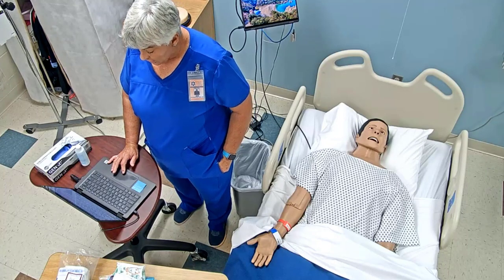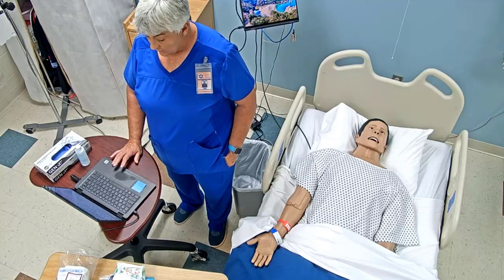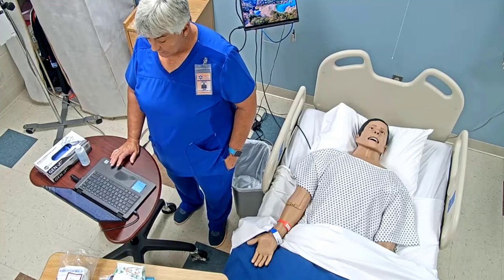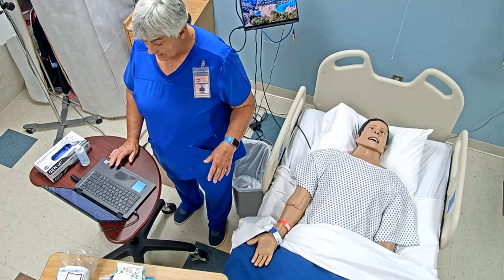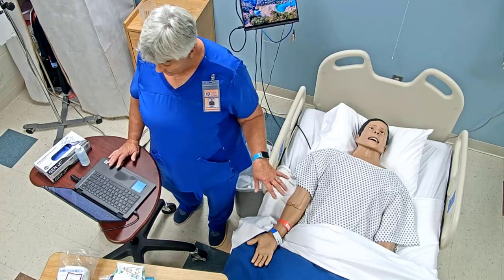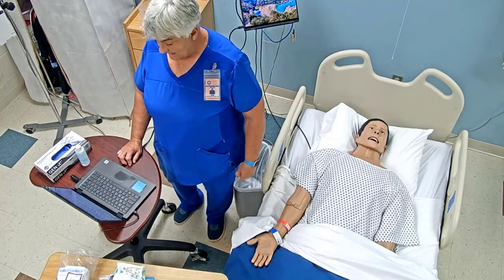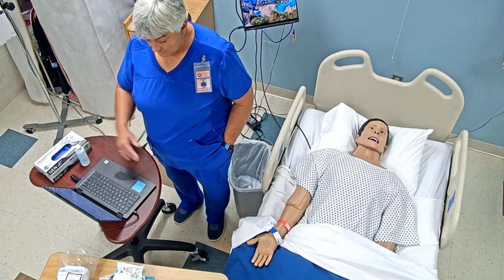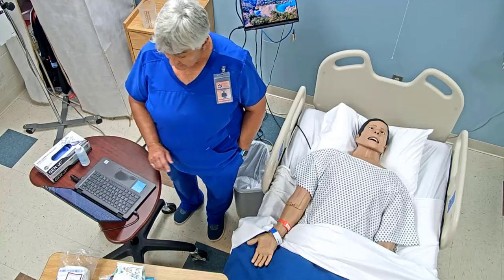I'm going to check my chart for any information I need to know about my patient. Specifically, we don't have any allergies, but does my patient have any problems with positioning? Is my patient able to cooperate with me? And I'm looking to see if I need to have any PPE on for this patient. But this patient is not on any kind of specific isolation.